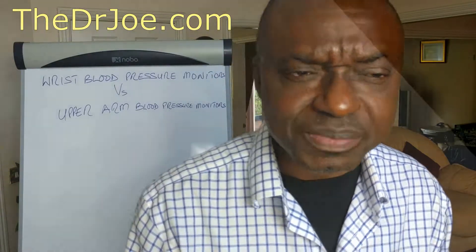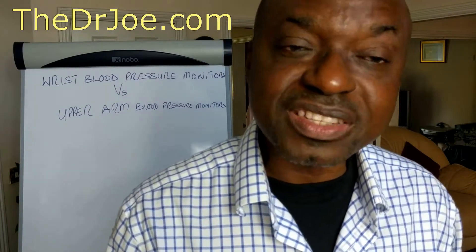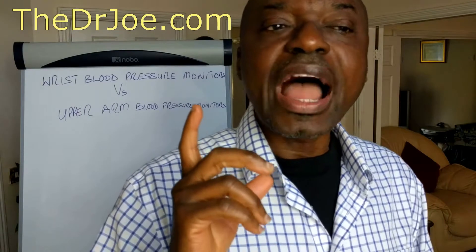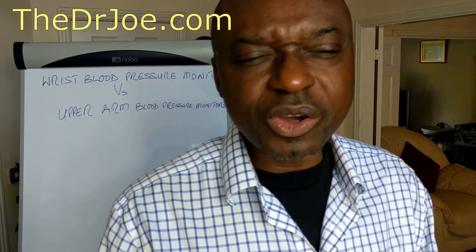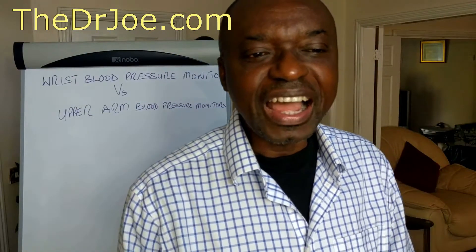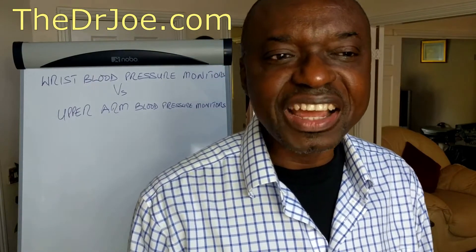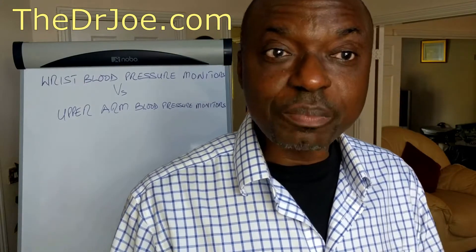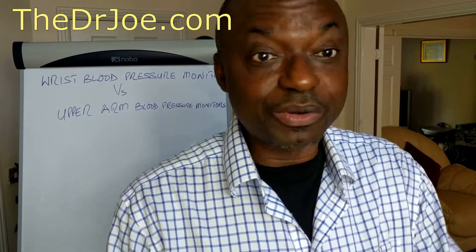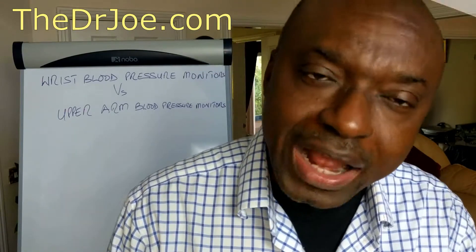Now, accuracy of blood pressure readings — because that's the most important factor in all of this. I'll tell you a story. I first came across wrist blood pressure monitors about four, five, six years ago. I saw a full-page ad in a newspaper talking about these wrist blood pressure monitors. I thought, that's a great idea. So I got one for myself. It arrived in the post a couple of days later and I was very keen to get on with it. I applied them and I was getting some really wild blood pressure readings.